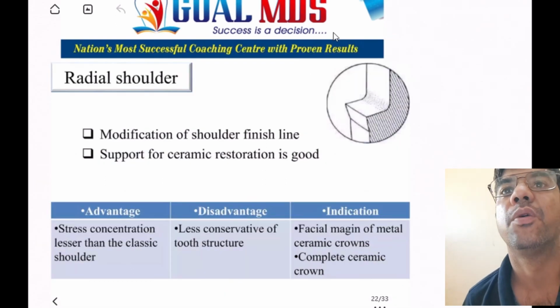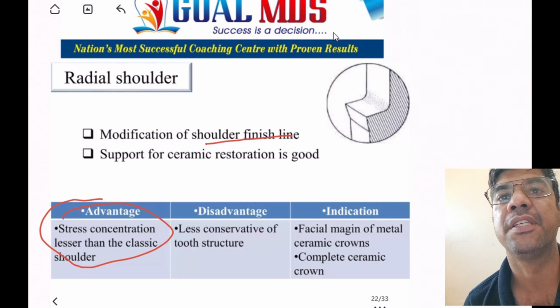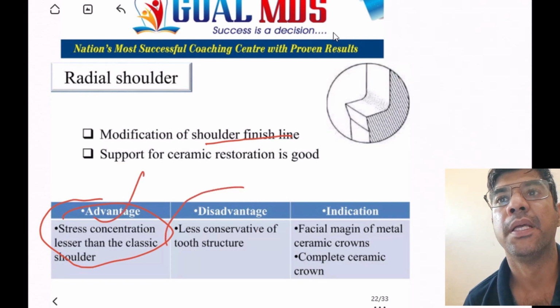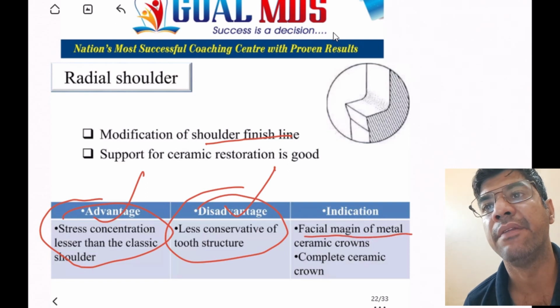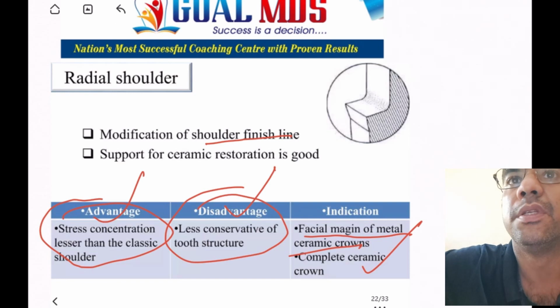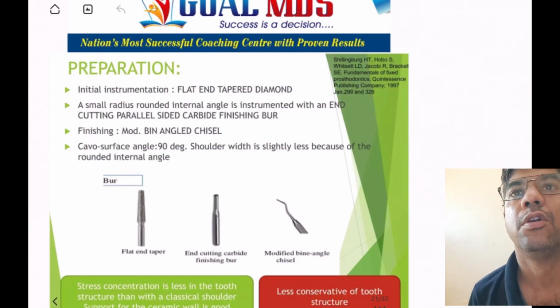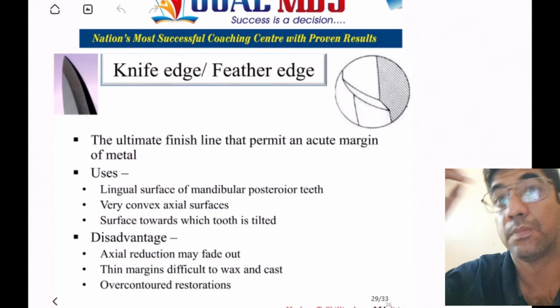Other is radial shoulder. It is a modification of the shoulder finish line. There is stress concentration lesser than the classic shoulder, but there is less conservation of tooth structure, and it is indicated in the facial margin of metal ceramic or complete ceramic crowns. So a flat and tapered diamond bur is used to prepare the radial shoulder.